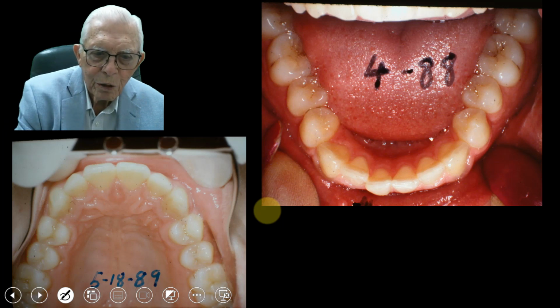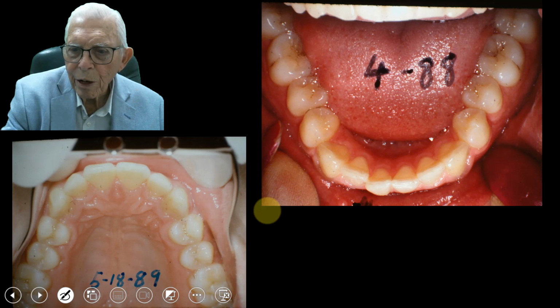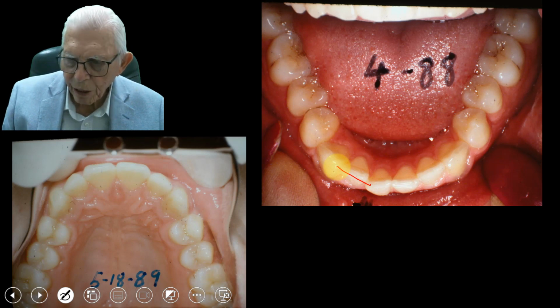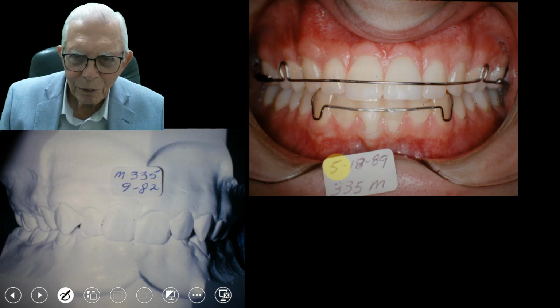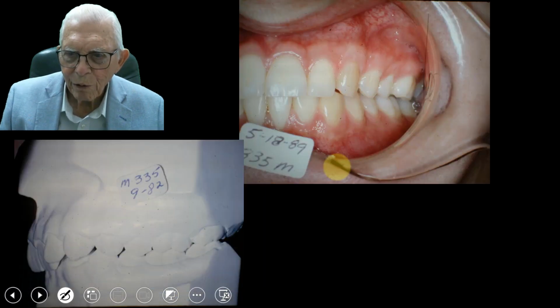This is where we started the case. This is the upper, and this is the lower right in here. This we'll end up bringing that tooth round better than it is in that position there. Now there it is, and a retainer we put on the bottom. I don't like those retainers, so I don't use that very much. And so you have the bite was deep. That's the finish part of it.